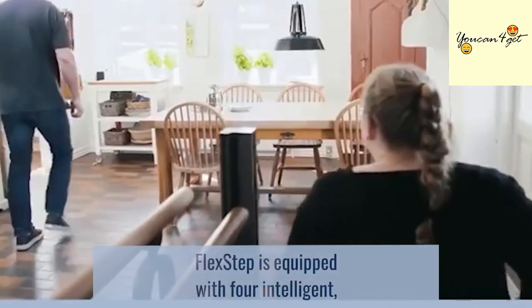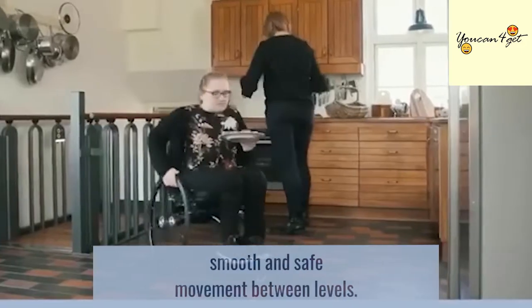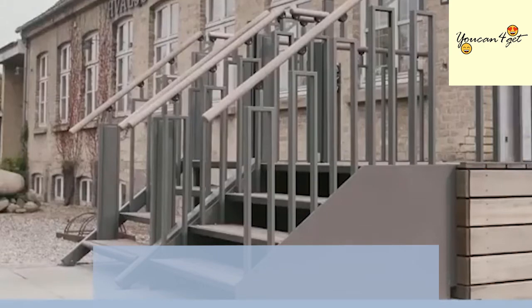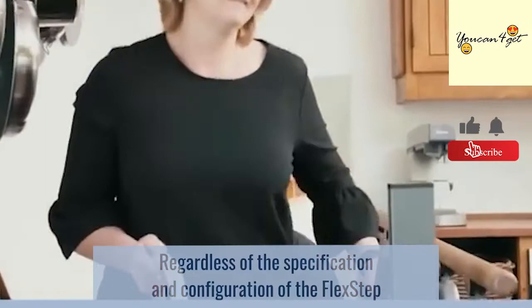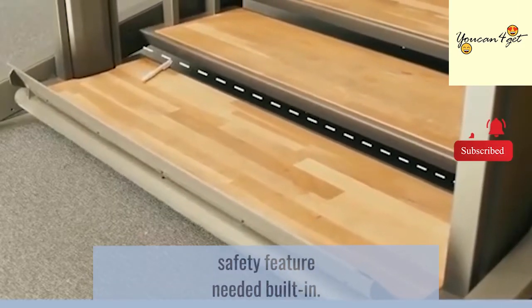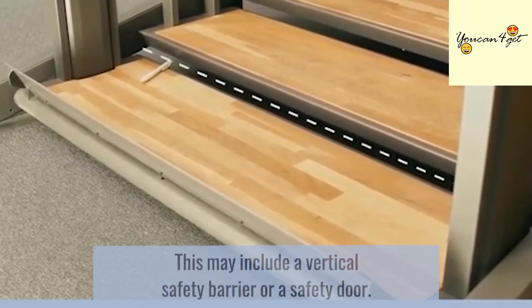FlexStep is equipped with four intelligent, synchronized motors, one at each corner, which collectively ensure smooth and safe movement between levels. Regardless of the specification and configuration of the FlexStep you choose, each one comes with every safety feature needed built-in, which may include a vertical safety barrier or a safety door.